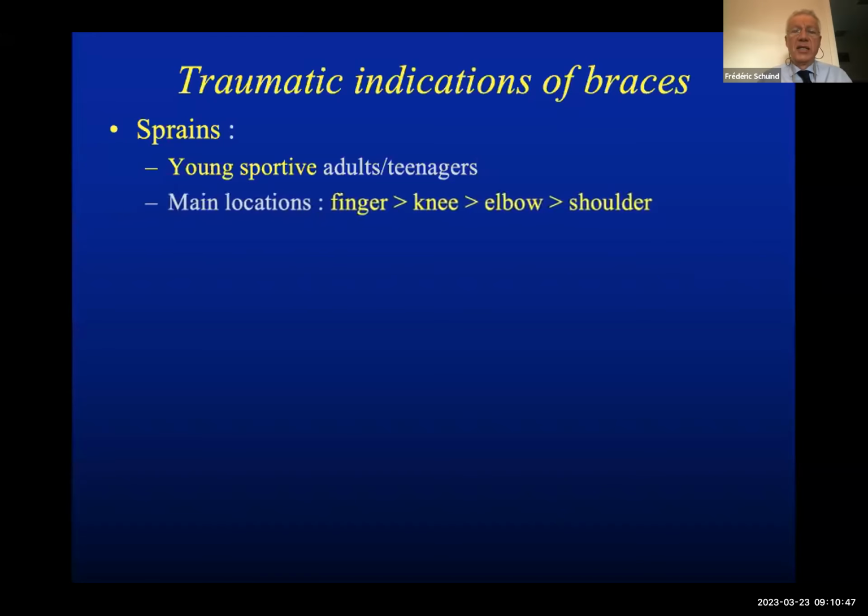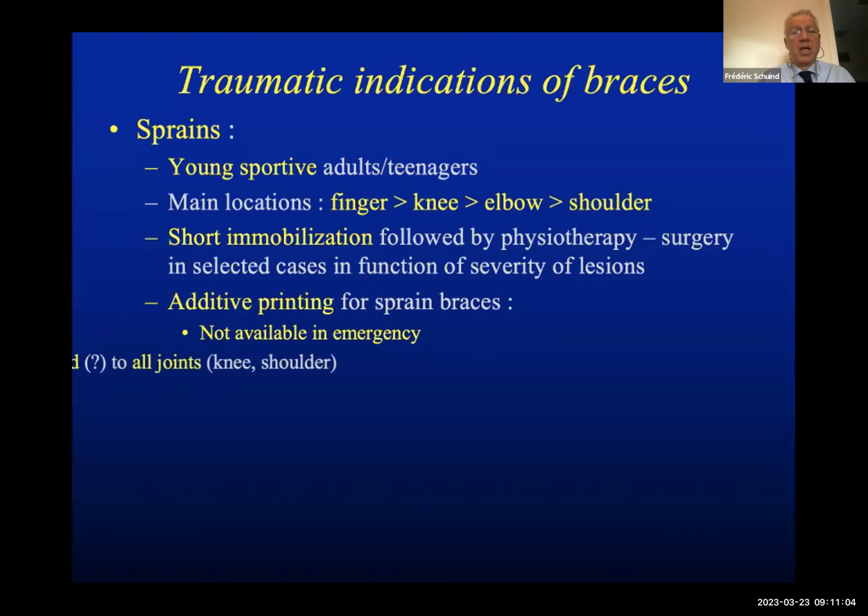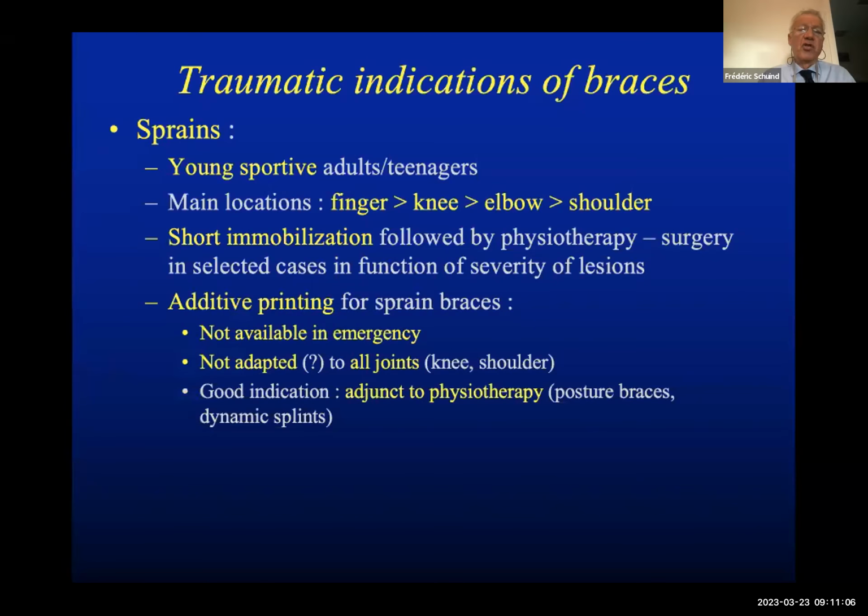Regarding the traumatic indications, it would be good to have 3D printing to treat sprains. Sprains affect young adults and teenagers who are sporting. Main locations are finger, knee, elbow, and shoulder. And the usual treatment is a short immobilization followed by physiotherapy. Sometimes a surgery, depending on the severity of the lesions. And additive printing is actually not used, to my knowledge, for sprains because it's not available in emergency.